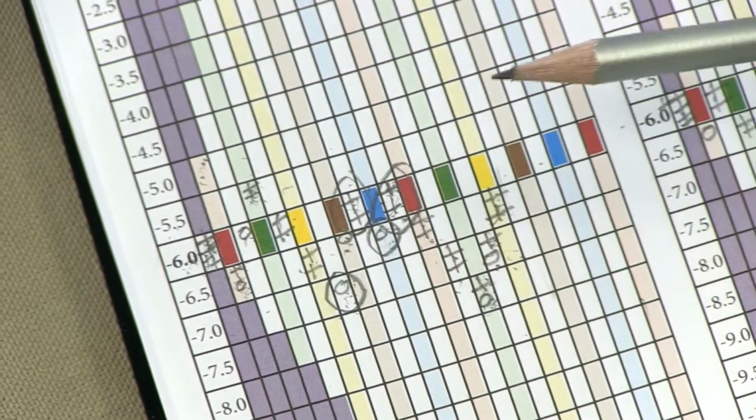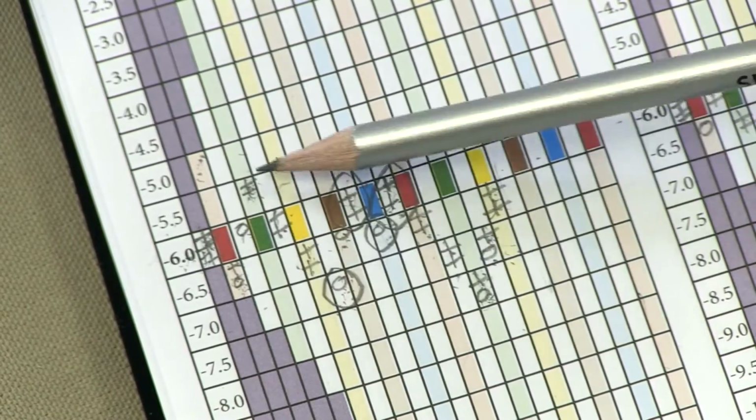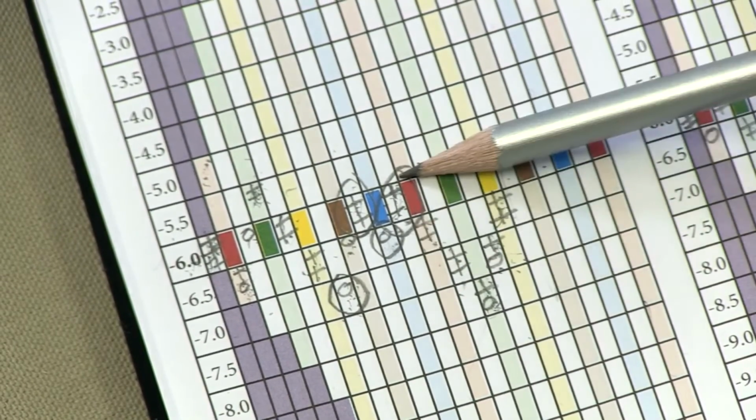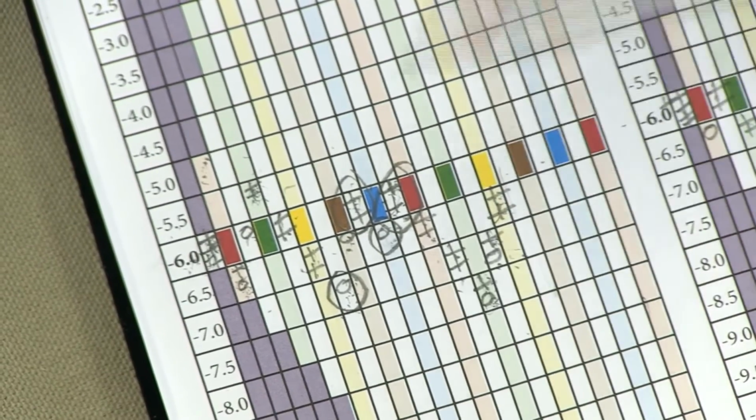We moved back up. So ultimately, we ended up with 1, 2, 3, 4, 5, 6, 7 reversals, and that's where we'd ordinarily stop and average the data. Typically, we only do 7 reversals, but for the demonstration here, I've done 9 just to show you how often these threshold values look.